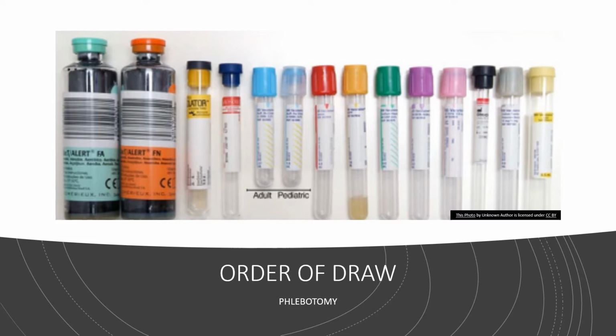So then there's some other blue top tubes there. The light blue tube is the one we're going to talk about next. That's the one you're going to learn most of in your phlebotomy classes. And then there's different variations of red. The one next to the red one, which is a yellow, and we'll go over all this in lab. This is just a starter point for you that you can look back on, is what we refer to as an SST tube, which is a serum separator tube.